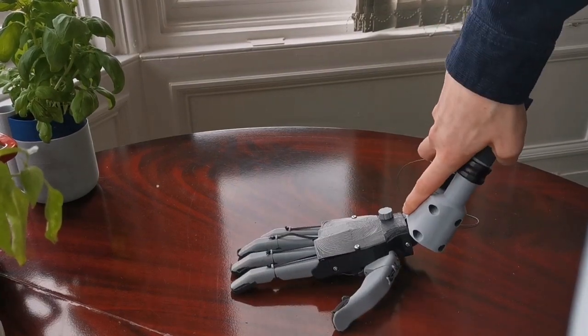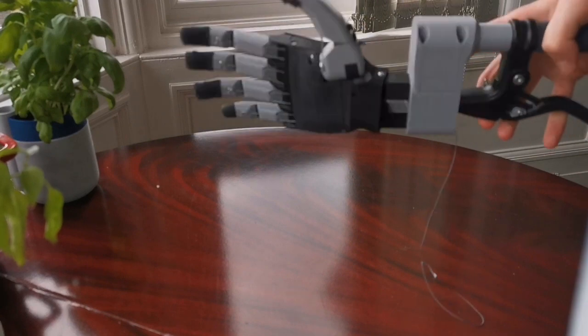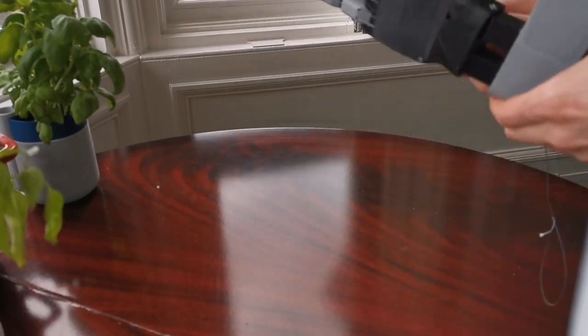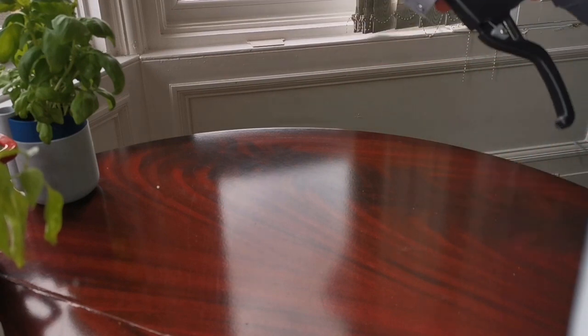Also new are the two compliant bones, which prevent the product from breaking when large forces are applied. This means you can use it to lift yourself off things, and it's a feature rarely seen in other devices.